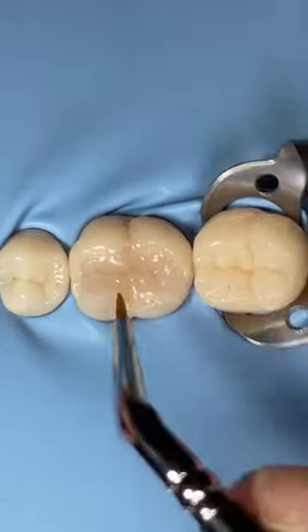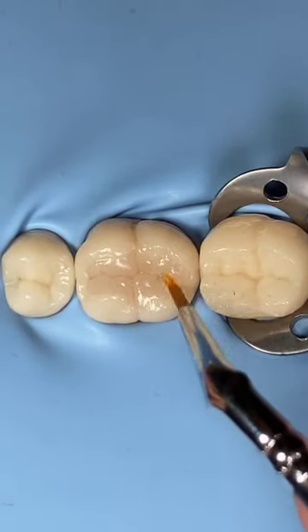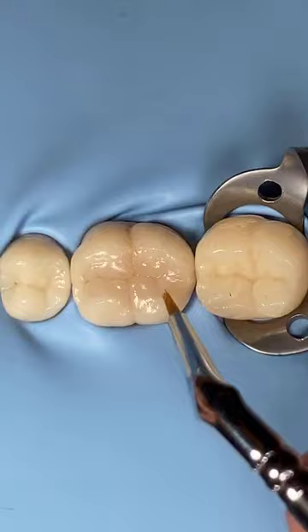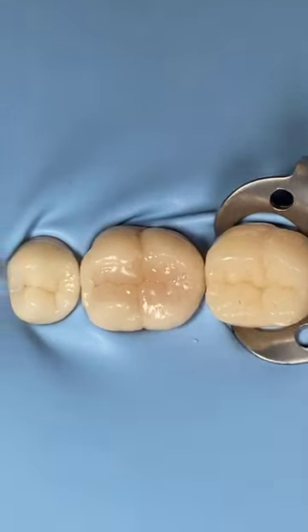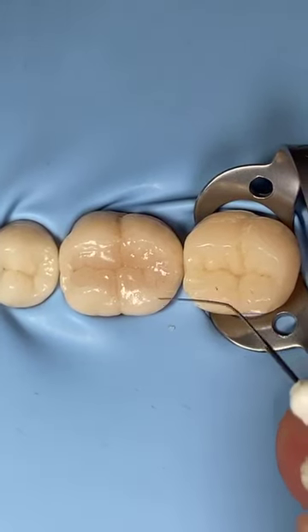And then don't forget the second step. The second step is your magic brush. So please, for this brush, just don't try to use a different brush or another brush. This is the best brush, I think, for now.